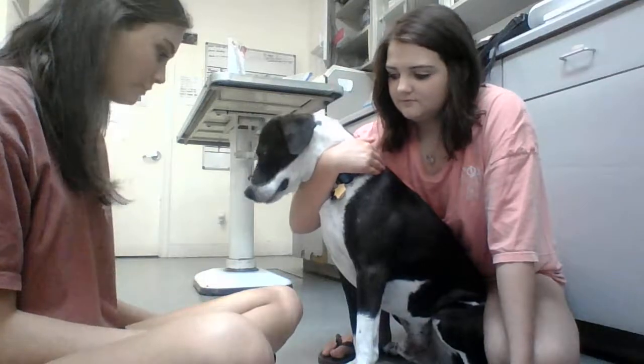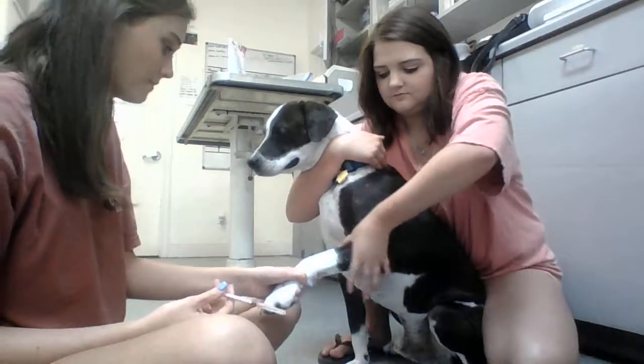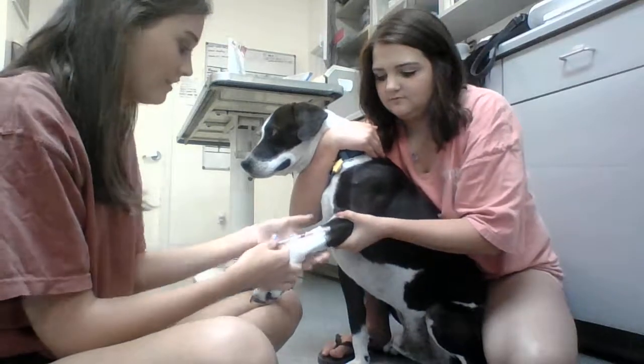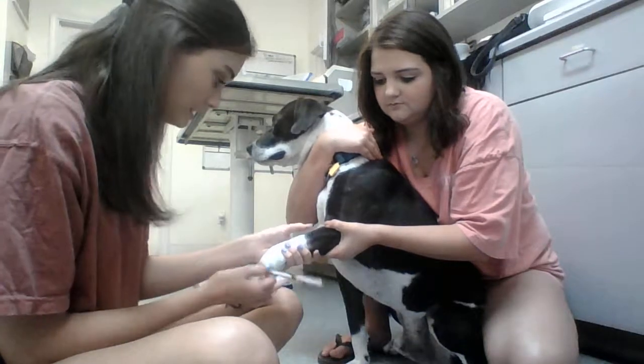When I go to draw blood from a cephalic vein, I first ask my restrainer to hold off the vein for me, just like that, and then I feel for the vein to make sure that I can feel it before I just randomly stick.